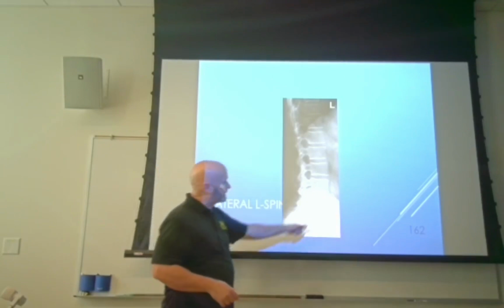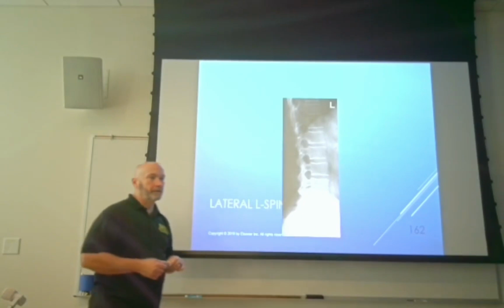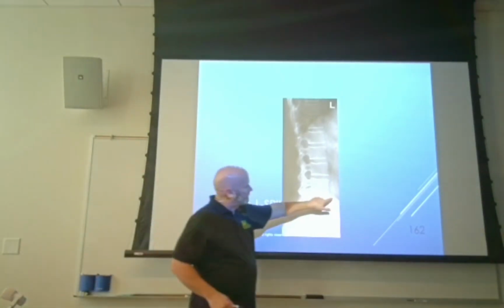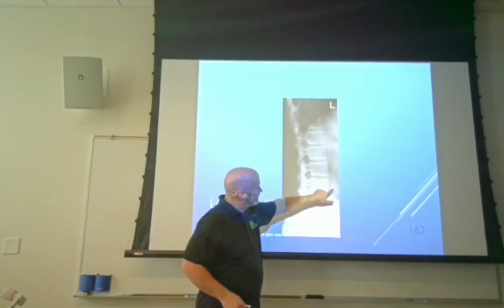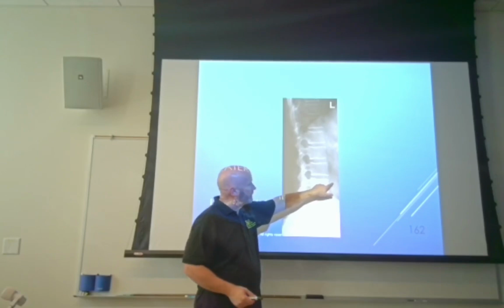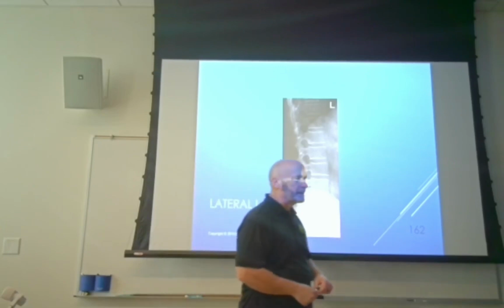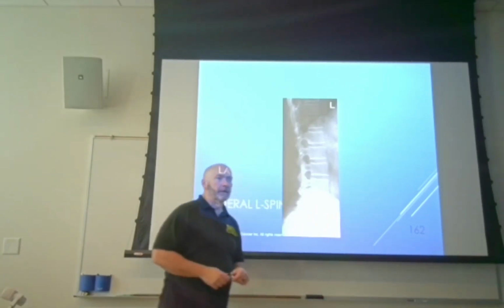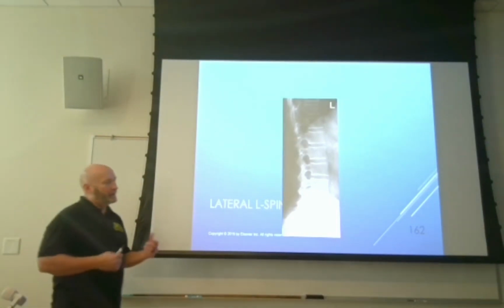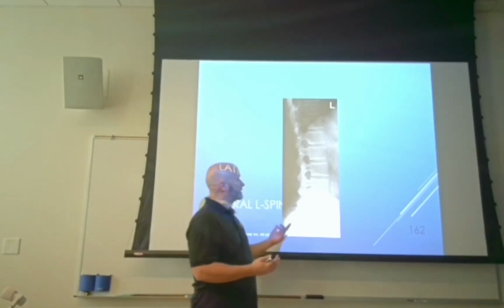Okay. You see this right there? You know what that is? Any idea? Can't see it? This is a little bit of increased density right there, or increased patient density, decreased radiographic density. Can you kind of see what I was pointing at over there? No idea? I don't know this for sure. We'd have to see more x-rays.